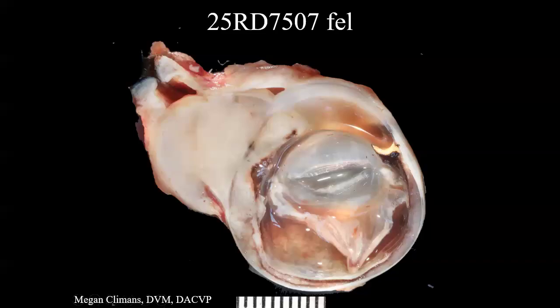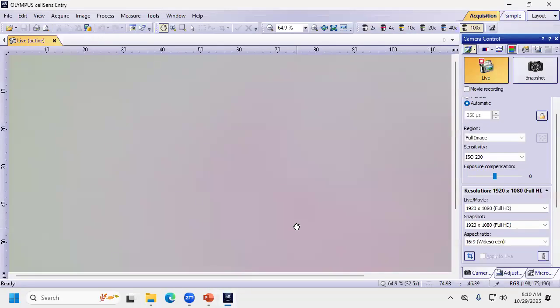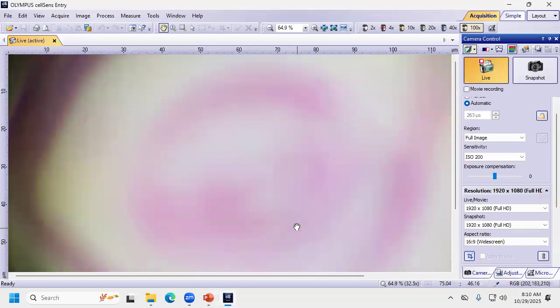This case should be quick. I picked it because it was quick. Oh, and I already gave away the diagnosis. Dang it. Now it's really quick. Now we're done. Just visualize. You've all seen this before, so let's go on. I wanted to do this as a not exciting case, just a straightforward case.